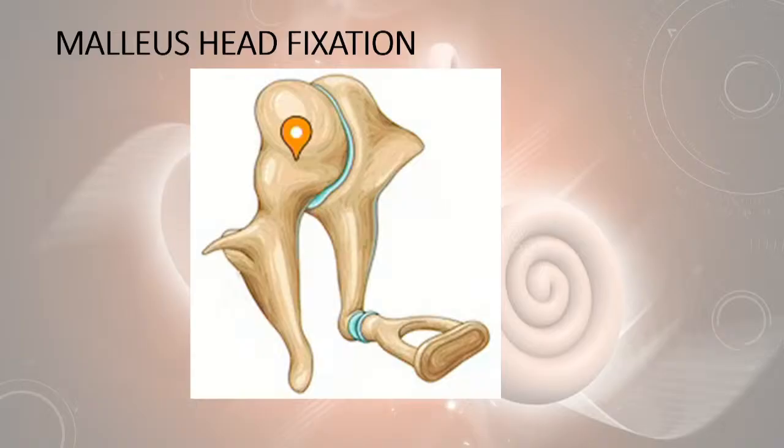The medical aid said, no, you can only do coronals. So we only did coronals, and we had quite thin slices, but I was looking for a malleus head fixation and could not see it. It wasn't visible on the slices we had. Subsequently, we went back and convinced the medical aid we needed axial slices as well, and we were able to see very nicely that it was indeed there.